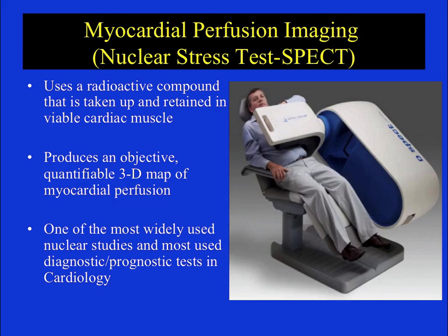Now, in the second part, patient is allowed to take rest, and we may or may not inject the same tracer to the patient depending on the type of tracer that I'm going to explain later. And the same gamma camera is used to acquire the images again, but this time we do not stress the patient. This is the resting image. So the images acquired when the patient is at rest forms the rest images, and these two sets of images, stress images and the rest images, are displayed side by side or alternatively, and we look for any differences or any changes between the stress and the rest images. This is in simple term how an MPI imaging protocol works.